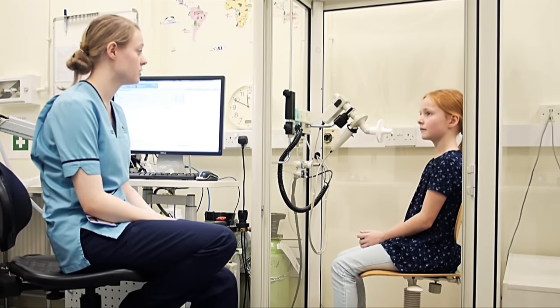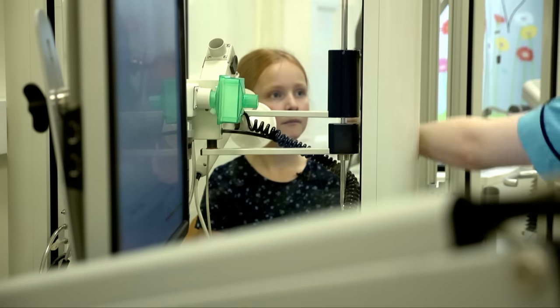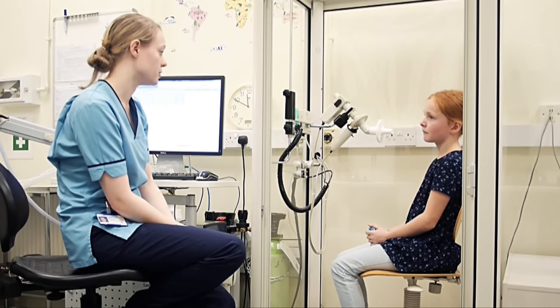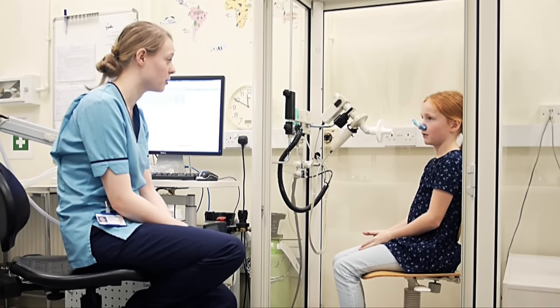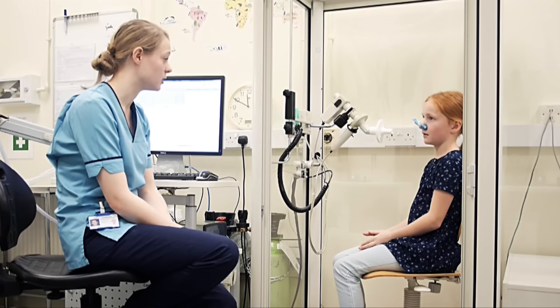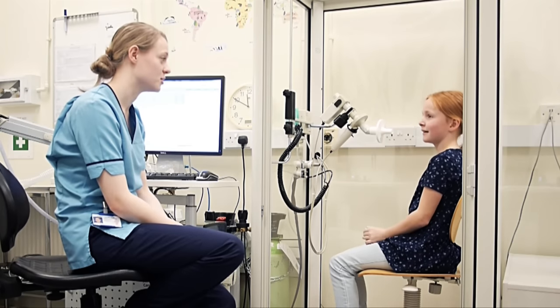Here we go. And we'll just explain how this test works. So we get you to wear your nose pegs for this test as well, but the other thing we have to get you to do is pop your hands up onto your cheeks, and that's just because there's a shutter in here, and when the shutter closes, we don't want your cheeks to move around too much. Okay, the first thing I'll get you to do is I'll just get you to sit in the box and not do anything for about a minute, and that's just because the box gets a wee bit warmer when you go in there, and we want to allow it some time to settle. Then once we're ready, you can put the nose pegs on and pop your hands up onto your cheeks.